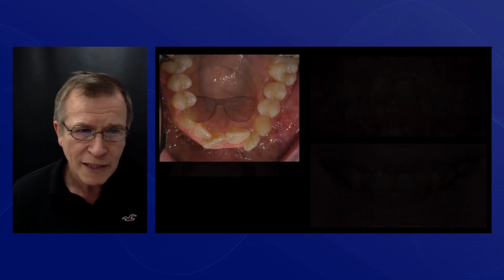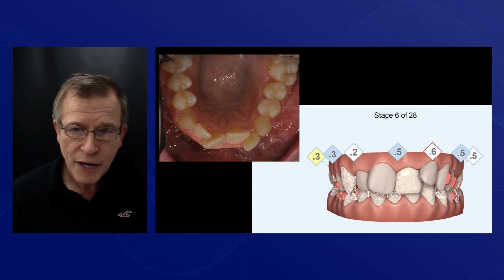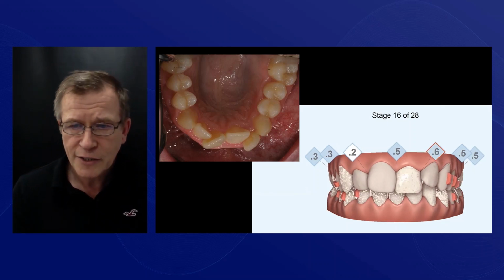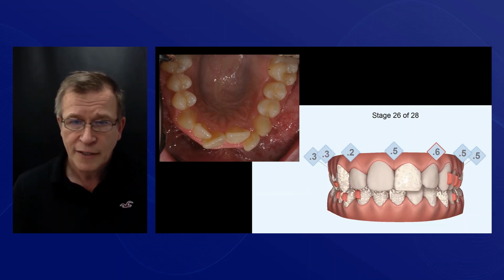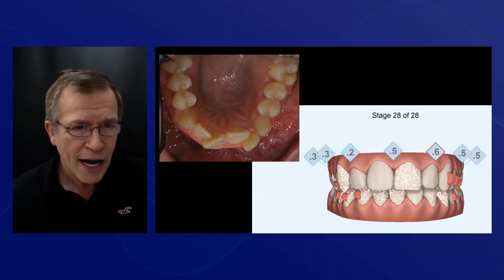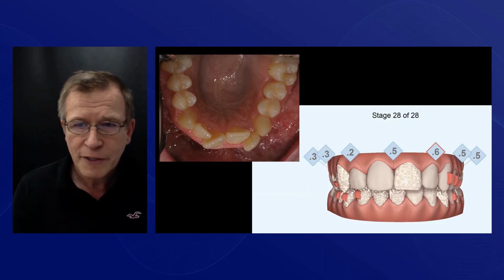I always say to them, I want you to look great for your wedding day, but I also want you to look great for your next wedding. So we want this to last a long time. So long story, very short, we managed to persuade her that orthodontics was achievable, that maybe we could do it with clear braces. And again, by being able to scan the patient and then send this to, in this case, Invisalign, we're able to share with her an idea about what we might be able to achieve and about how long this could take. And this is huge motivation and engagement for the patient.